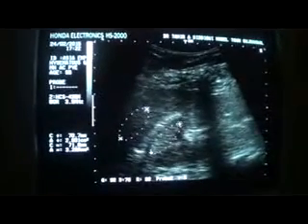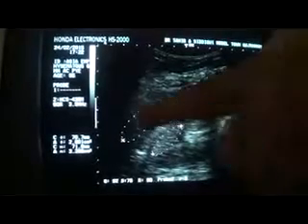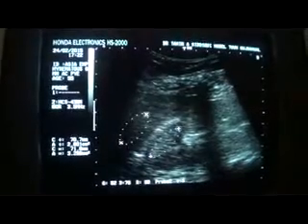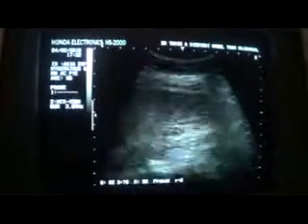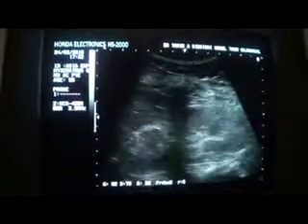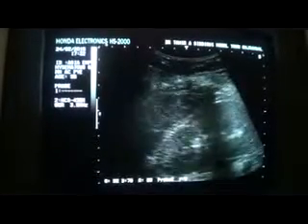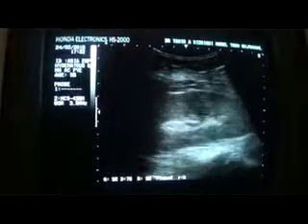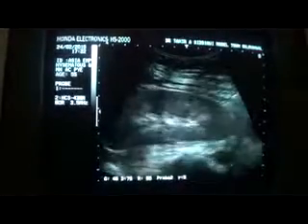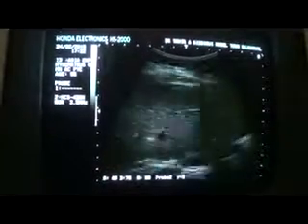Okay, so the echogenicity of the parenchyma is more as compared to the adjacent liver, which is opposite to the expected normal, because in normal conditions, the echogenicity of the renal parenchyma is either equal to or less than that of the adjacent liver parenchyma, provided the liver is normal. Here the liver is normal.